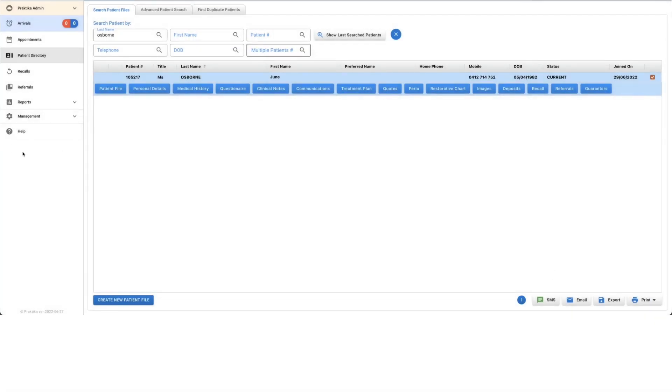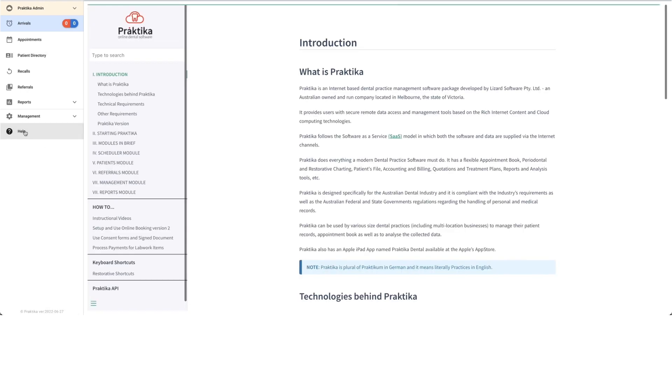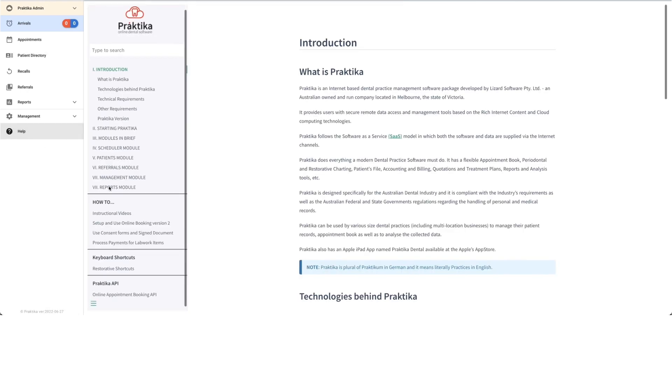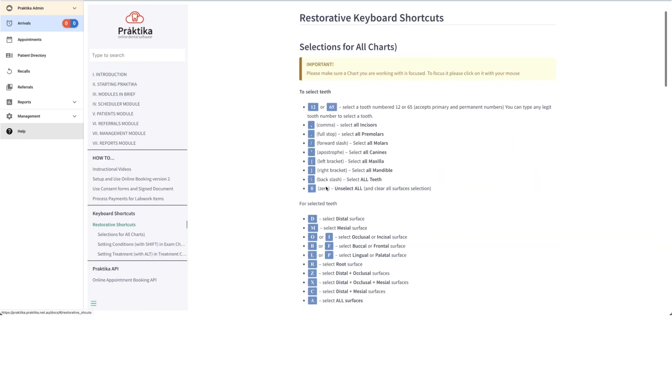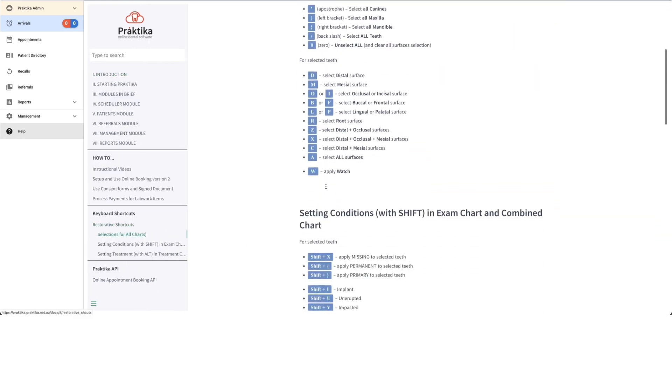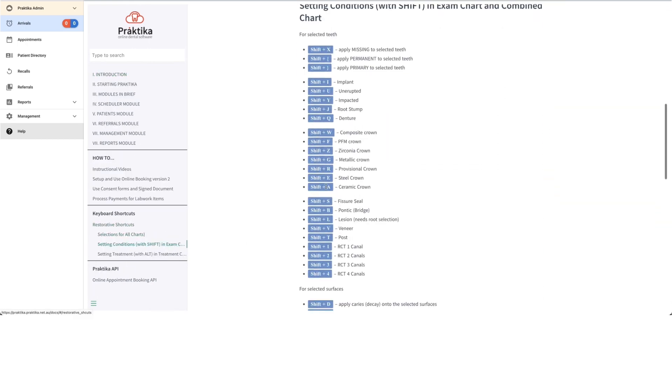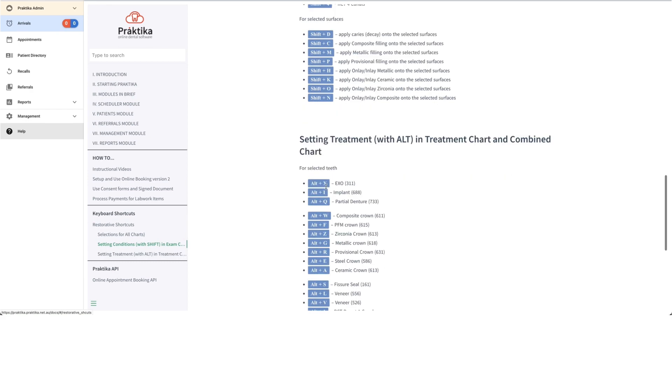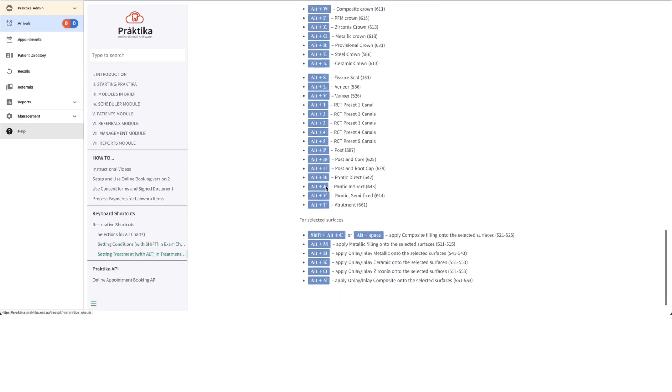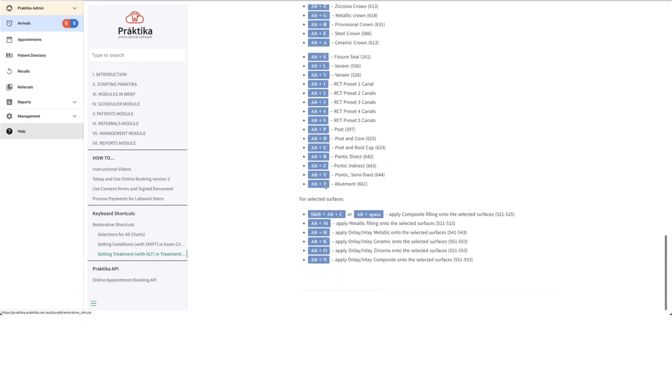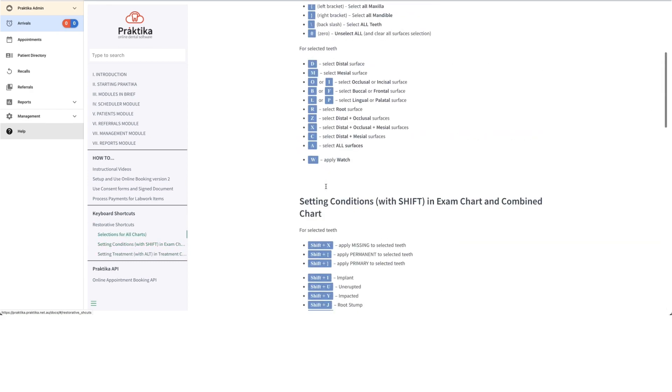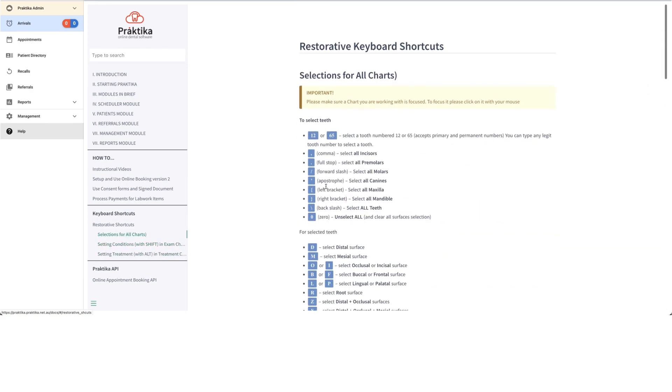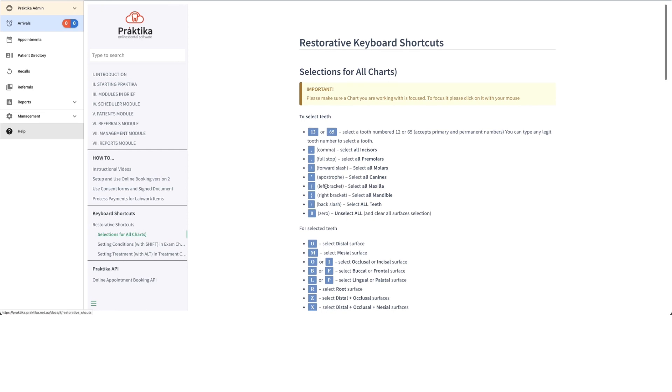That help section I'm referring to is over here on the left-hand side. So you can go to help, scroll down to keyboard shortcuts, and you've got your restorative shortcuts in here. So maybe print these out or just review them and see which ones you're going to want to use regularly, and then after a while they'll just be stuck in your mind. Thank you so much.